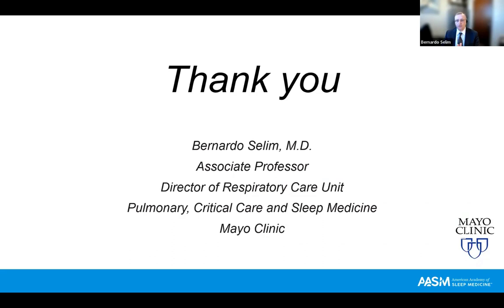It may influence your tidal volume, but the impact on your tidal volume really comes from the delta pressure and the inspiratory time, not so much the rise time. The rise time is going to influence it, but not necessarily change the tidal volume clinically. What the rise time does is generate the flow. When the patient tells you, oh, I feel hungry, I cannot breathe enough, that is when you put in a shorter rise time, so it jumps from EPAP to IPAP, and that abrupt difference of pressure generates a higher flow, so they feel like they get a blow. The contrary, they say, oh my God, I'm being blasted out of my sockets with this.